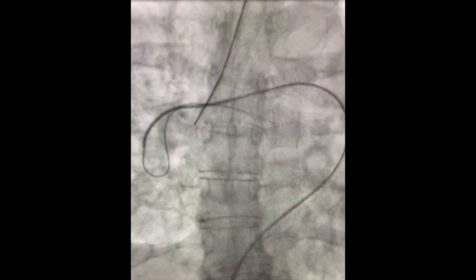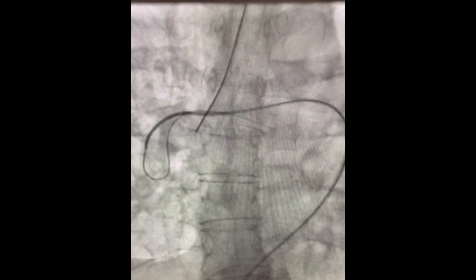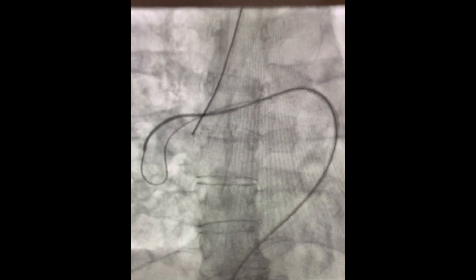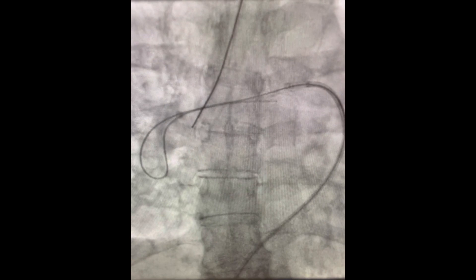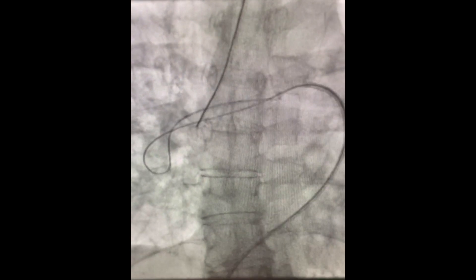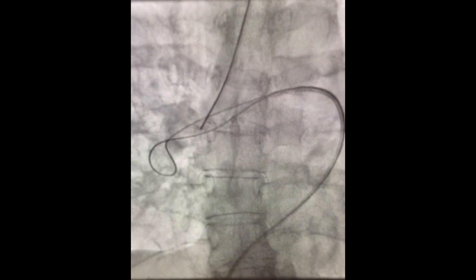So we had to use a 5-French glide catheter, a more supple and flexible catheter. And you can see the catheter telescoping technique with a 7-French by 70 sheath being advanced over the 5-French catheter and all the way down to the interlobar artery of the right lung.